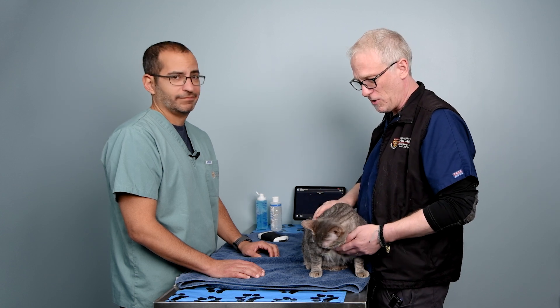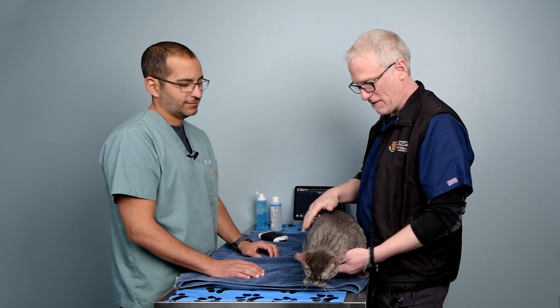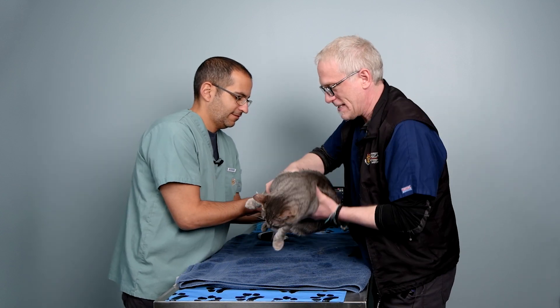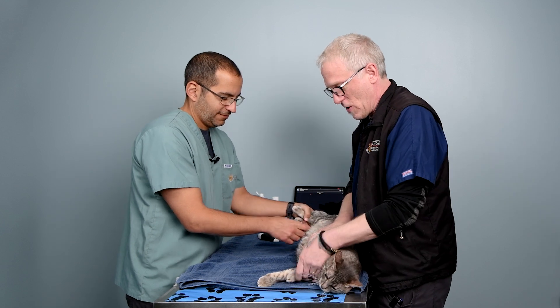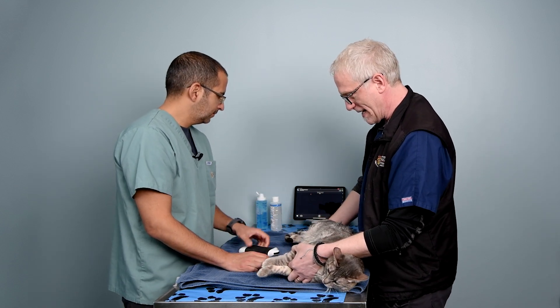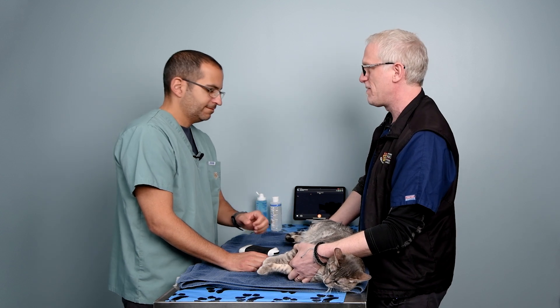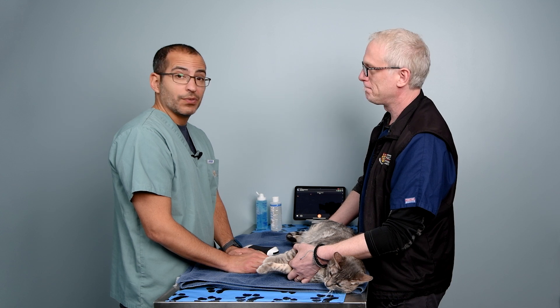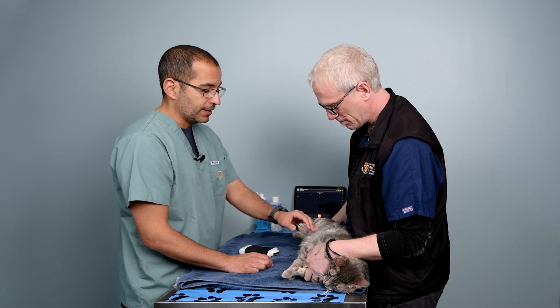We're going to start with the sub-xiphoid. We usually scan our patients in the position most comfortable. Daisy here is our volunteer. We're going to lay Daisy in left lateral recumbency just to make this a little bit easier to understand. We'll start again with that sub-xiphoid site and go through all the questions we ask and answer there. How do we find that sub-xiphoid location with confidence? That's actually the most important thing to do before putting the probe on the animal.